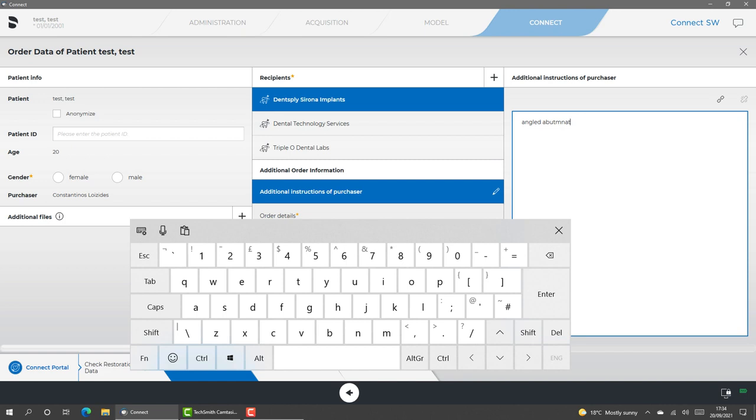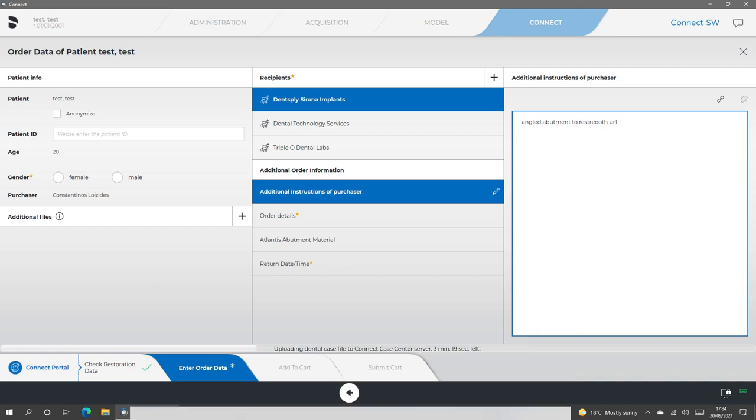That is going to allow me to correctly seat and have a decent emergence and a nice looking restoration at the end of the day. Okay, apologies for the poor misspellings. I must admit, it's one of the things I'm not particularly excited about on the Prime Scan, the keyboard coming up on the screen, but it's not the end of the world. I can live with it.